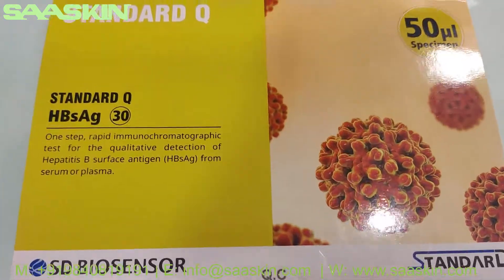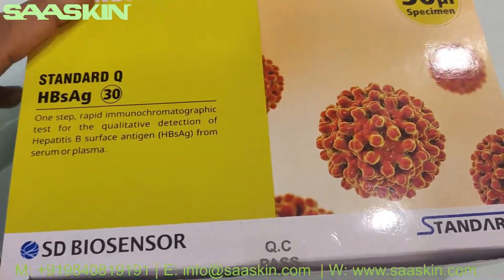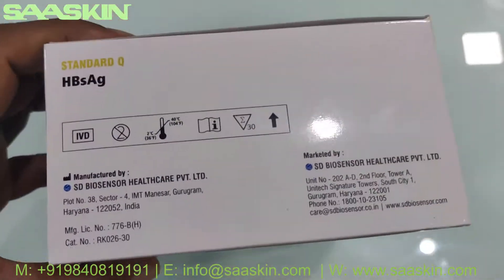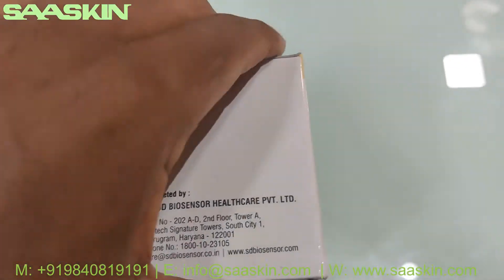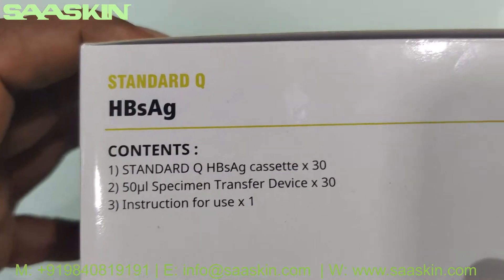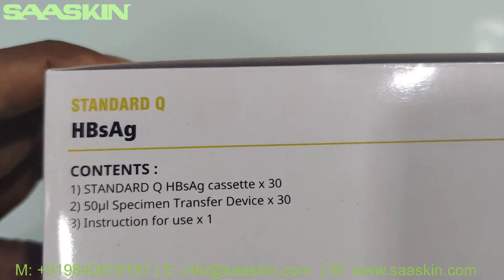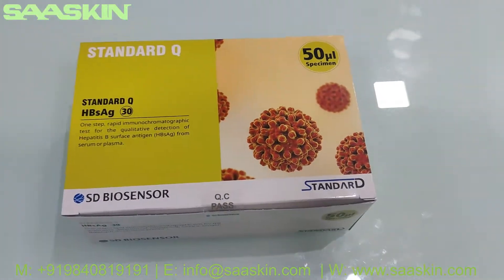Let me go through the box. It's manufactured by SD Biosensor India. On the standard, you have two years of validity. Here are the contents: you get 30 test cassettes, 30 transfer devices, and one instruction for use. That's how the box looks like.